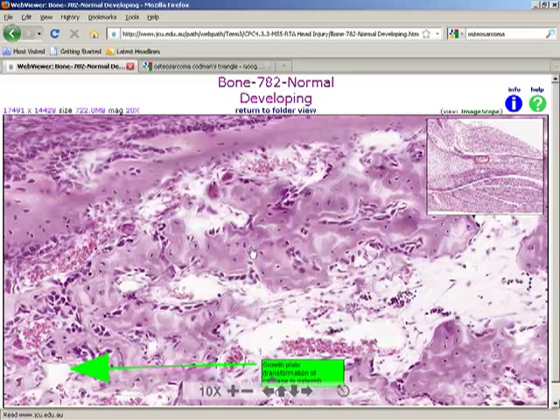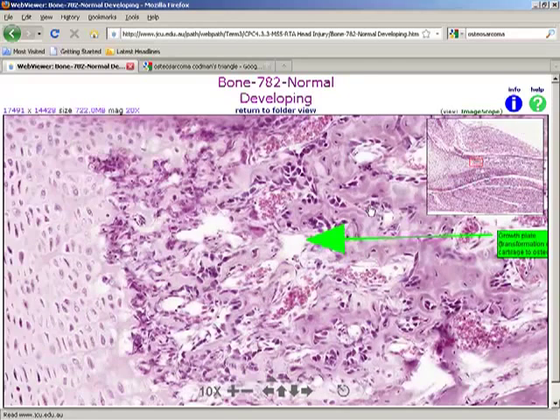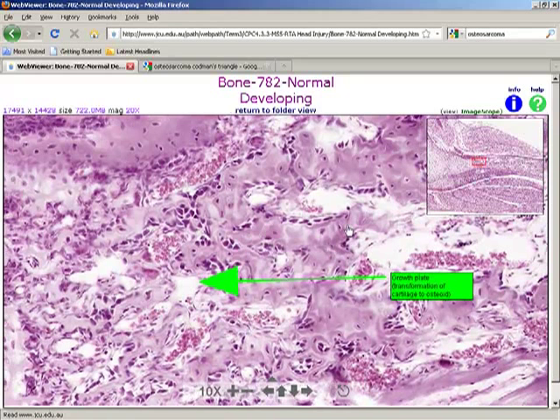See the osteoid, irregular osteoid, lined by plenty of osteoblasts. See, these are all osteoblasts. There will be few osteoclasts, and they are remodeling the bone through osteoid tissue. That's the cartilage. So breakdown of cartilage and replacement by trabeculae, the bone, and that is the growth plate.